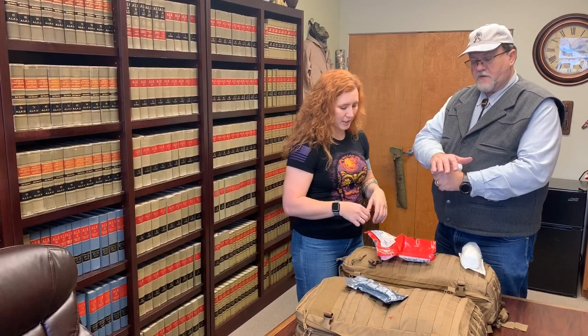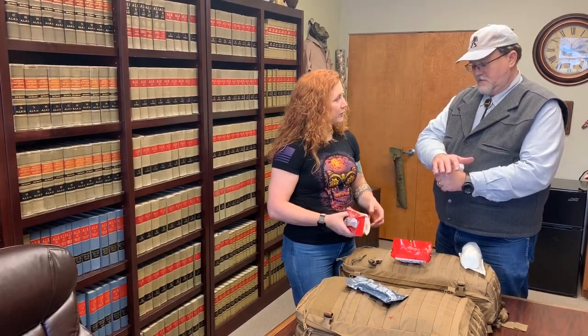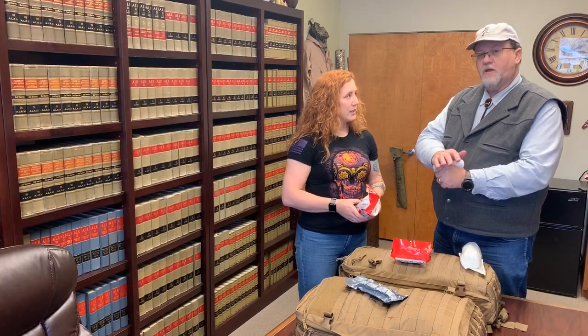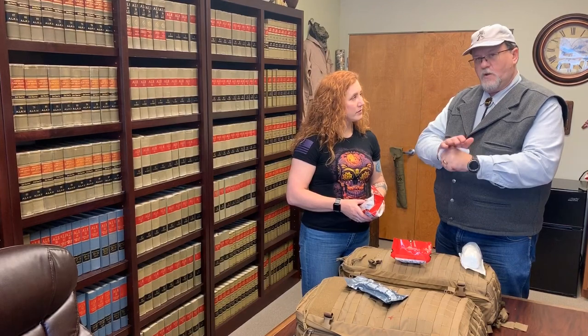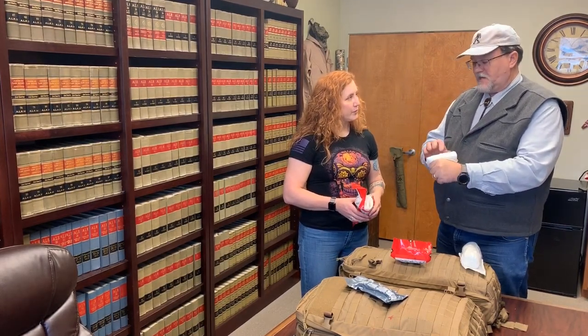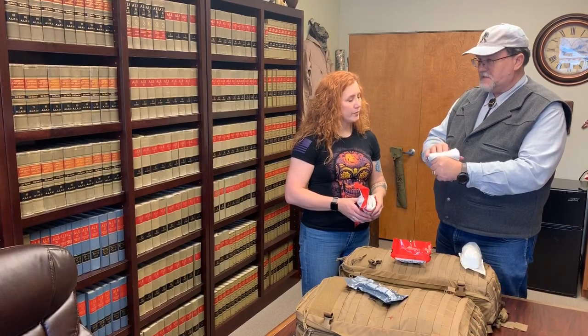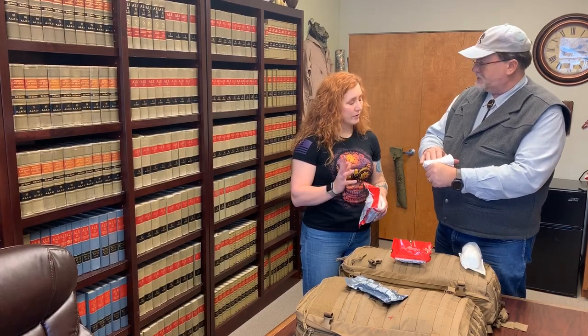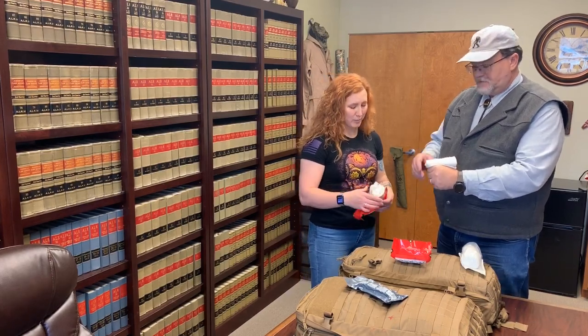I watched a video earlier that talked about compression — like when you're doing compression, it's almost your whole body weight. You're really pushing hard. Something I didn't really realize. I thought you'd just be pushing some. But when you get this kind of wound, you are really putting pressure on it. This gauze has hemostatic agents in it as well, so you're holding that down for three or four minutes. It takes a little bit of time for the blood to clot.